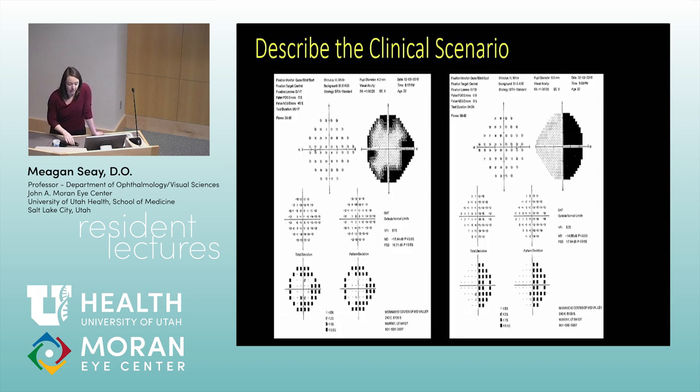Now how about this? Make up the clinical scenario for this. The left eye looks like a clover leaf, so a lazy patient with something going on in the right eye. They got tired of the right eye. Completely fictitious. So I made these. I was pretty proud of this. Got a little bit over on the left, though. That's awesome. My clover leaf isn't perfect either, but it's not too bad.